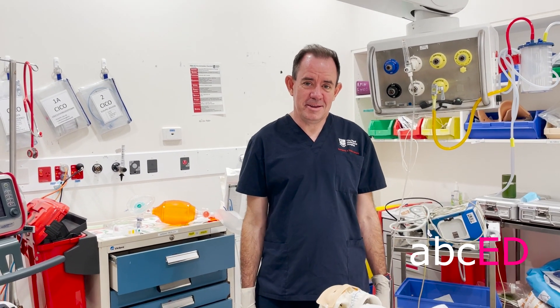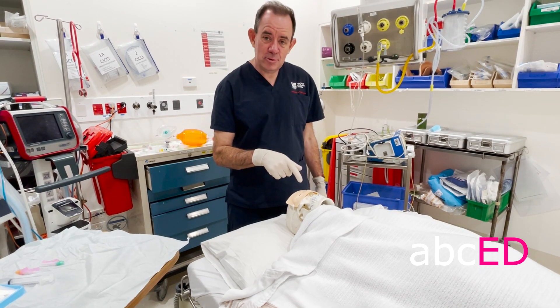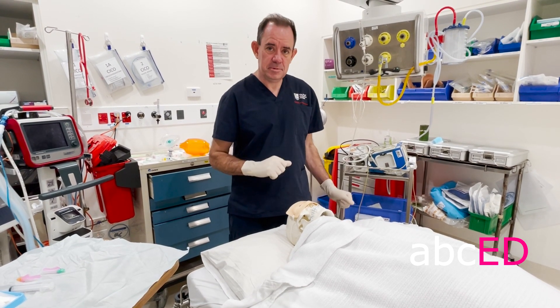Hi, it's Jonathan, welcome to ABCD. We're going to do a lateral canthotomy today. This poor man has an orbital compartment syndrome. He's lost vision in his left eye, his pressure is 40, he's got an afferent pupil defect and he's got proptosis.